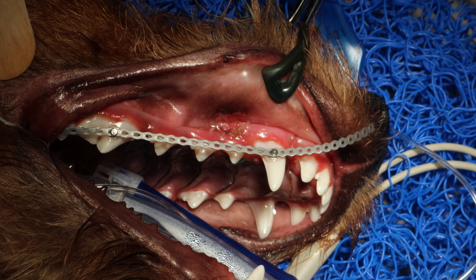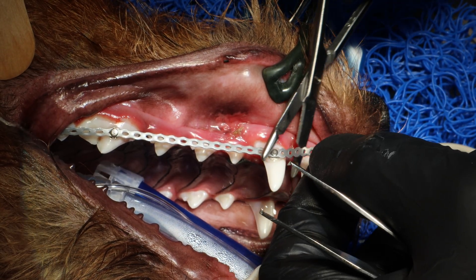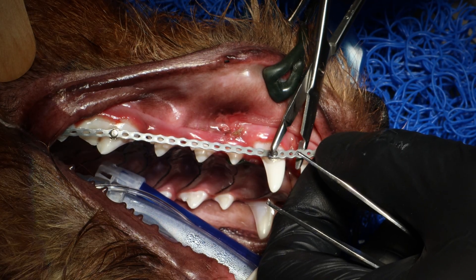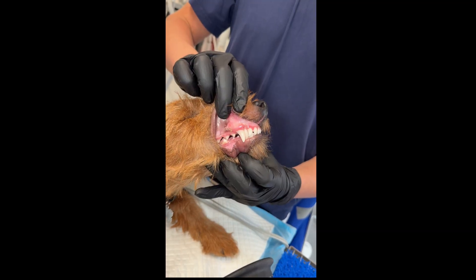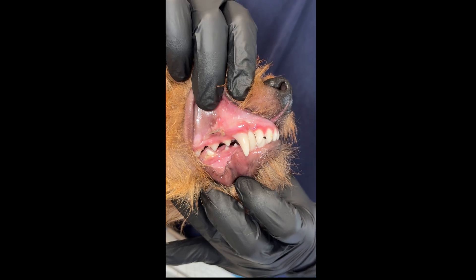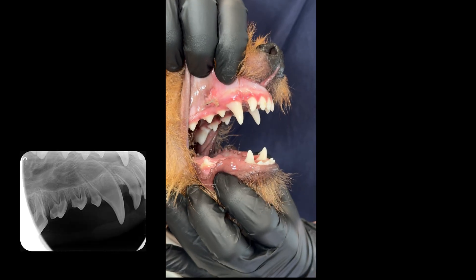This video will demonstrate how to put on a power chain to do an active orthodontic movement in a dog. It's important to note that orthodontics are only used to alleviate traumatic bites and traumatic occlusions, not for cosmetic purposes. This case was a six-month-old Irish Terrier with a class 1 malocclusion where 404 is linguoverted.